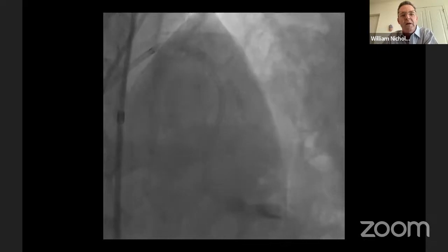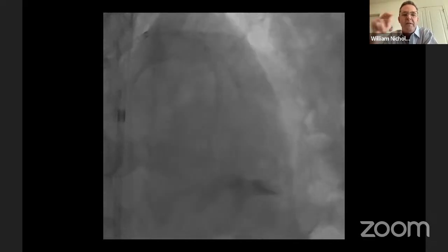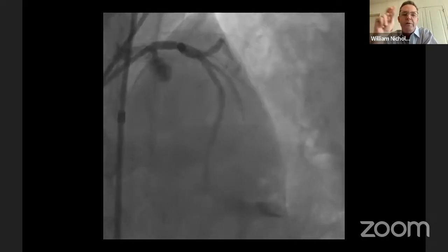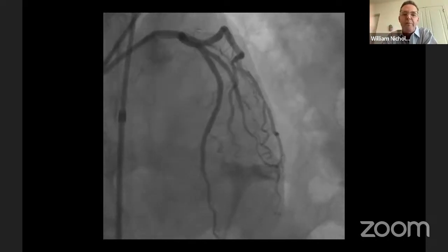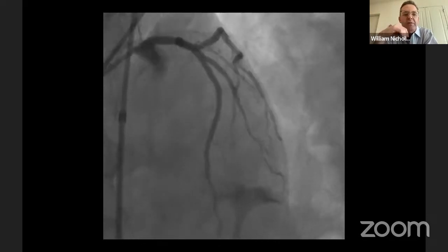So it's a lot of very complex things to overcome. It doesn't have the same complexity of the one issue that I was sort of pressing you a little bit about: what do you do when we aren't that fortunate, and our retrograde wire maybe did come through subintimal and we do have a flap between our two branches, and how do you best treat that? But I think it's a nice case.